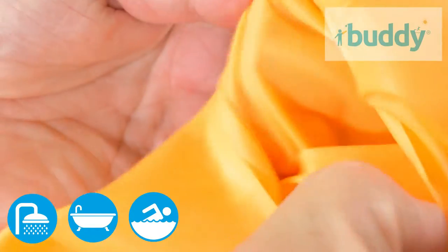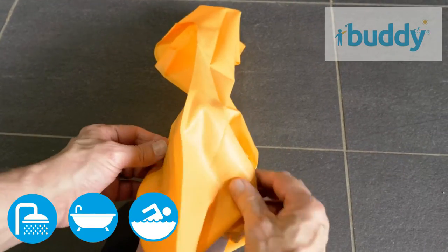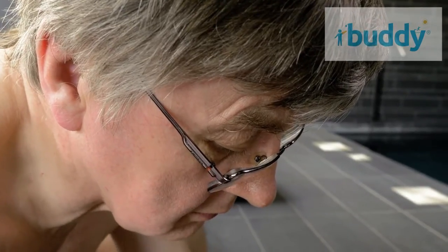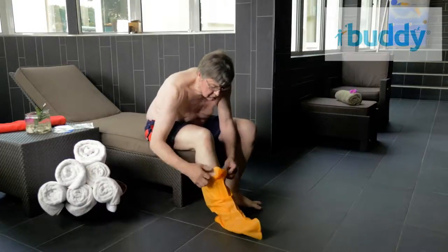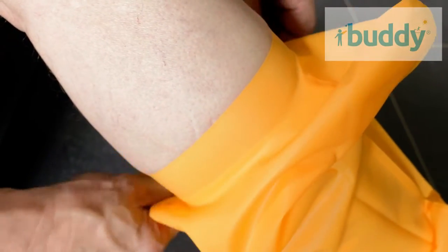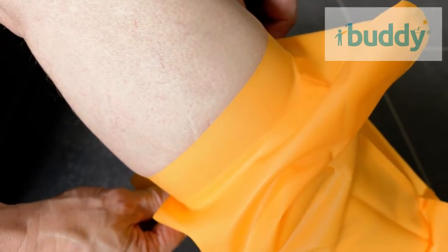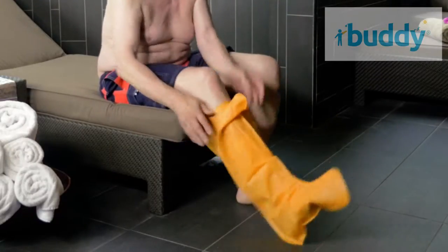Made from medical grade latex-free material that is kind to your skin, Buddy covers are incredibly flexible and easy to wear. Simply slip gently over your bandage or cast and pull up. Pull the corners down to create a smooth watertight seal. If you are having a shower, you're ready to go.